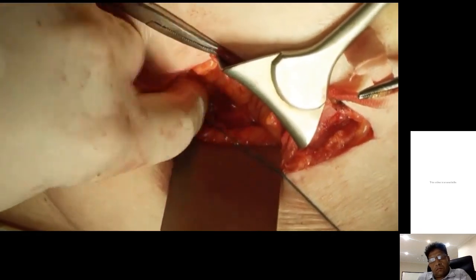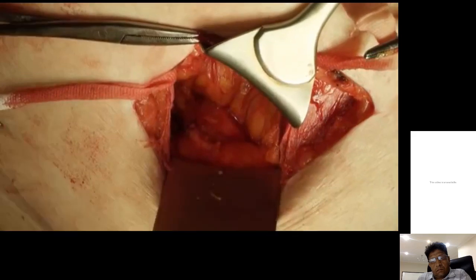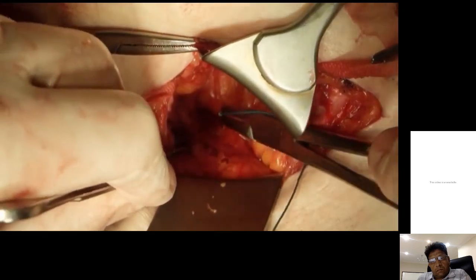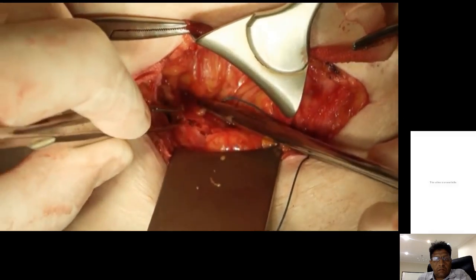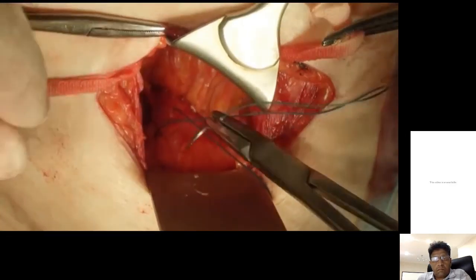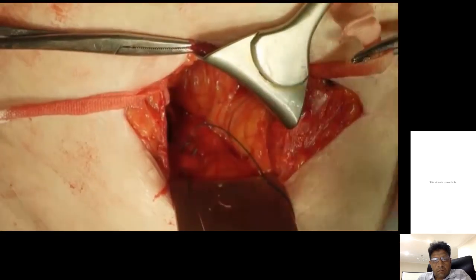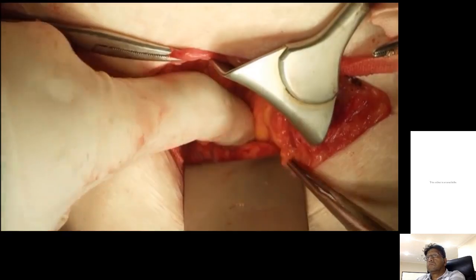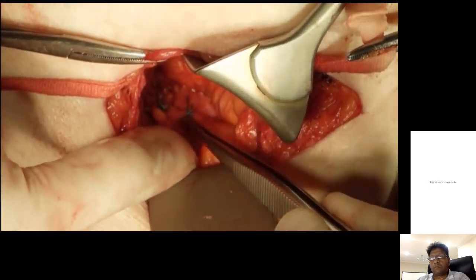So that's obliterated the inside of the femoral canal. And a couple of stitches like that's a sensible thing to do. Often you end up just getting the tissue overlying the pectineal ligament. The pectineal ligament's pretty fixed. It is a fiddly stitch to get. Again, there's the pectineal ligament, medially, lacunar ligament, anteriorly, inguinal ligament, laterally femoral vein. And we've occluded the femoral canal internally with two stitches.